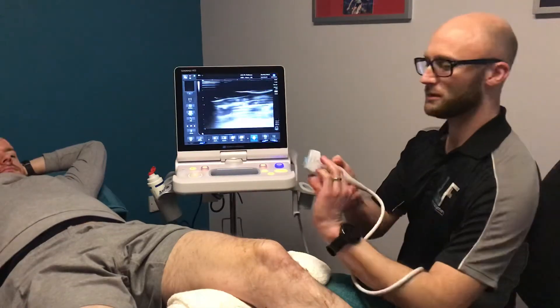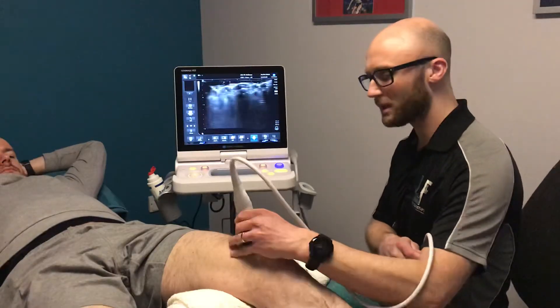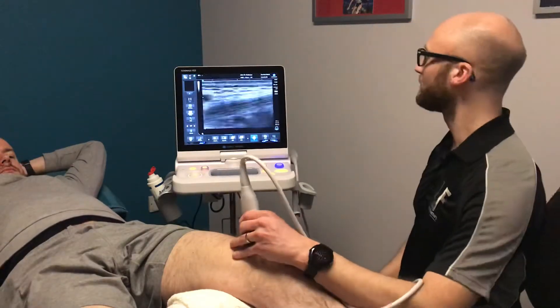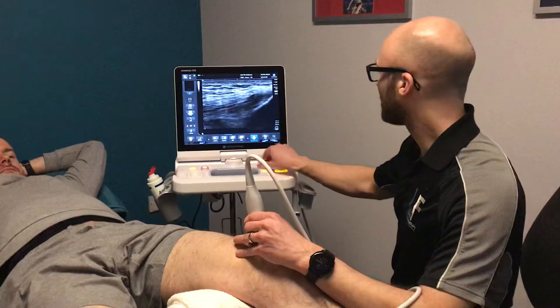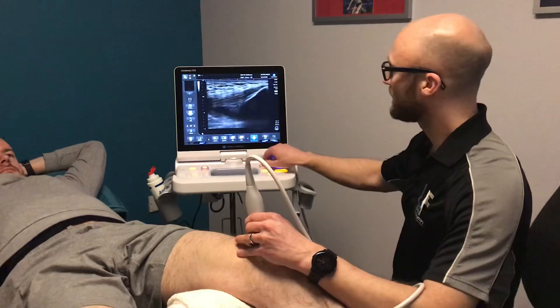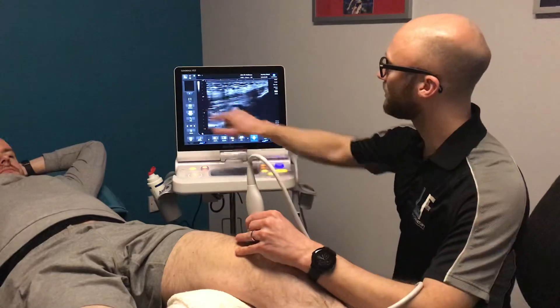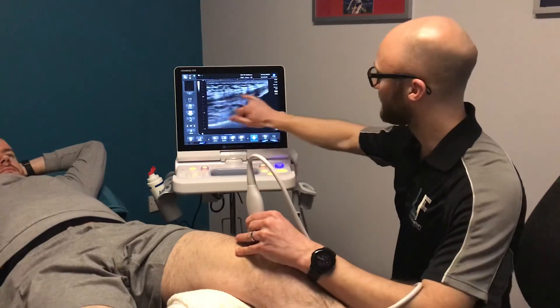We need a little bit of gel on the ultrasound probe to get good contact with the skin and we'll start at the top of the knee here. At the top of the knee we've got the quadriceps tendon — we've got the patella which is the kneecap, and looking higher up the body we've got the quadriceps tendon.